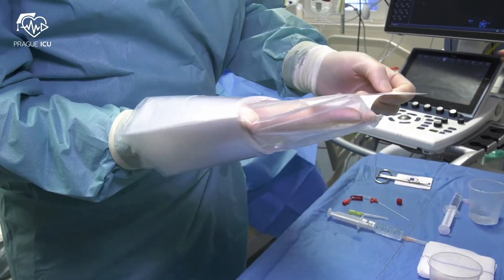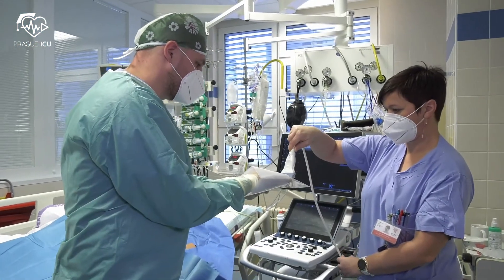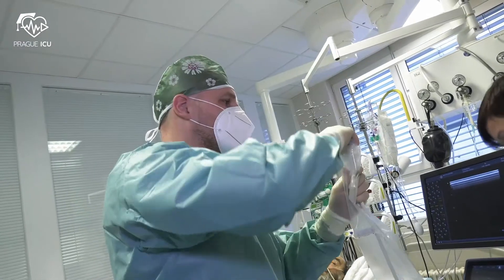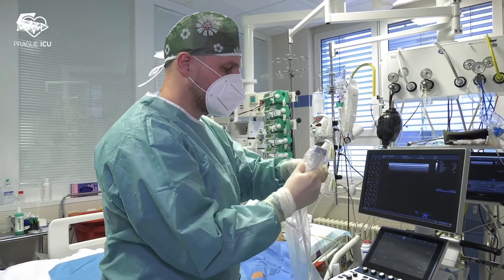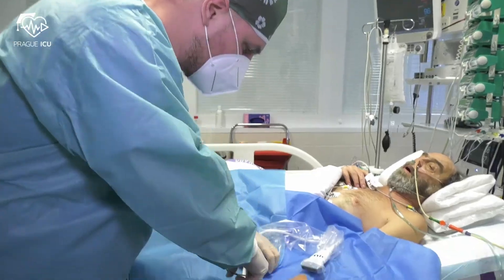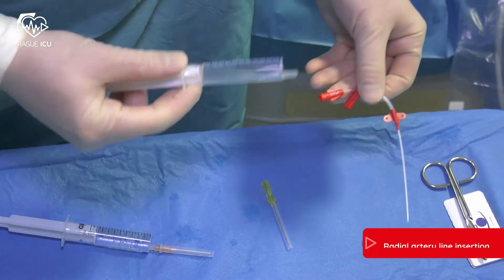Drape the forearm with a fenestrated drape and expand the sterile field with another drape. Put the ultrasound probe in a sterile cover. In this case, I use a cover with a sticker that serves as jelly. Remove any residual air bubbles. It might be a good idea to fix the ultrasound probe with a clamp to prevent it from falling. Never clamp the cable.